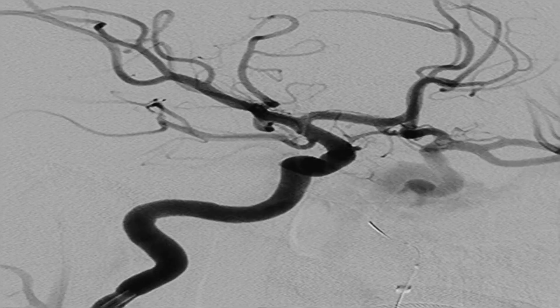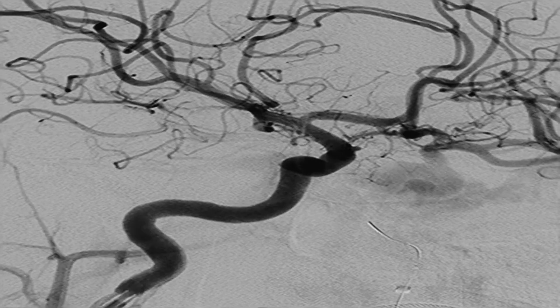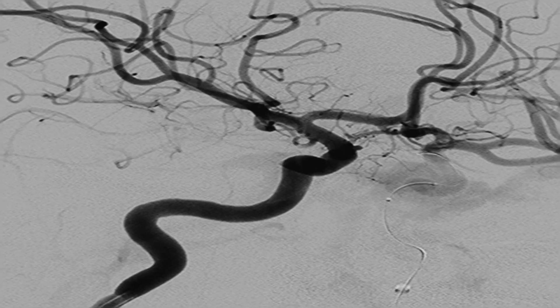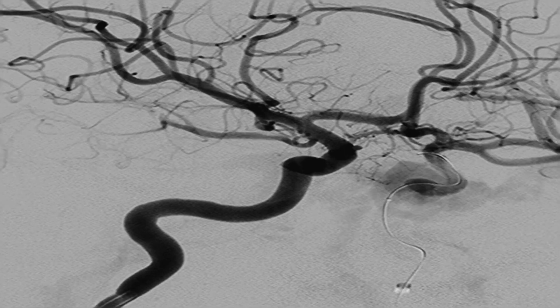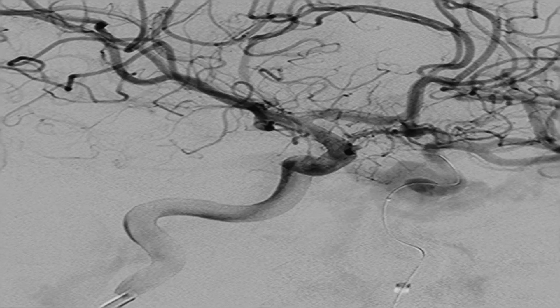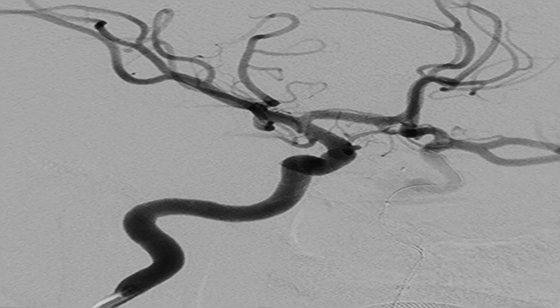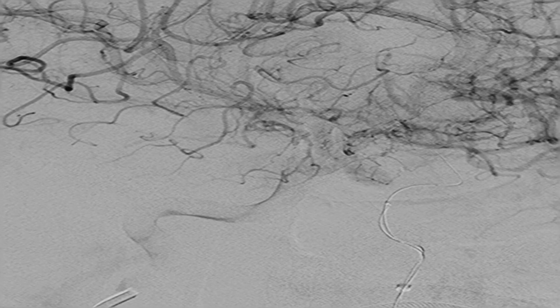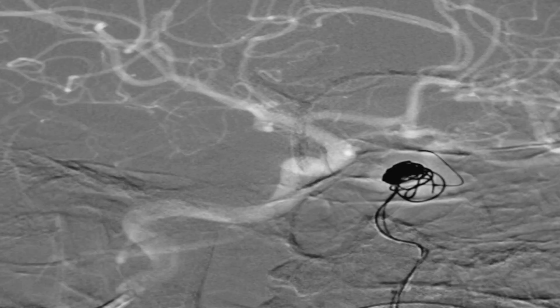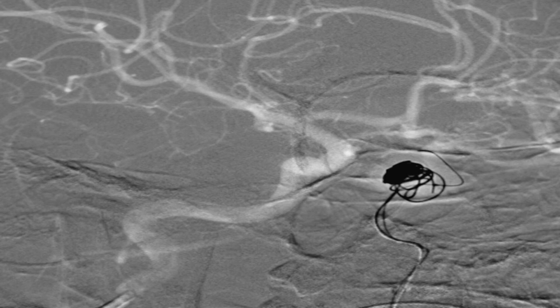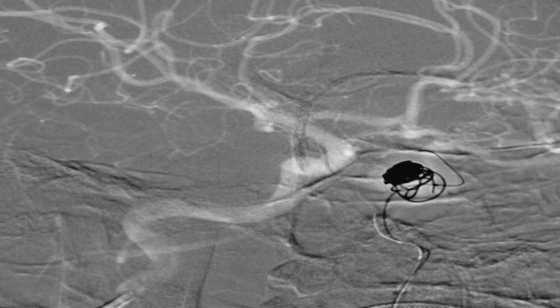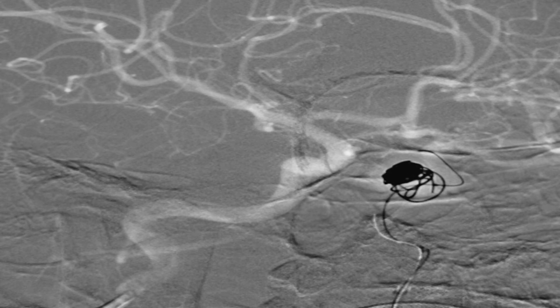Through the distal access catheter in the left ICA, the Echelon micro catheter with micro guide wire was passed, and the micro guide wire was advanced further into the distal ICA beyond the fistula site, keeping the Echelon micro catheter at the fistula site. A 150 cm, 4 mm × 10 mm Transform super-compliant balloon was then passed via the distal access catheter in the left ICA and inflated across the fistula site. After confirming proper balloon function and micro catheter placement, road map was obtained and packing of the fistula was started with multiple coils.